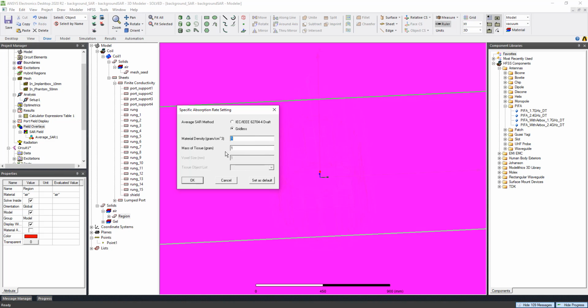After the mapping is over, HFSS will apply the two-pass average SAR algorithm to the voxels. Finally, HFSS distributes the average SAR from the voxels back to the FEM mesh.